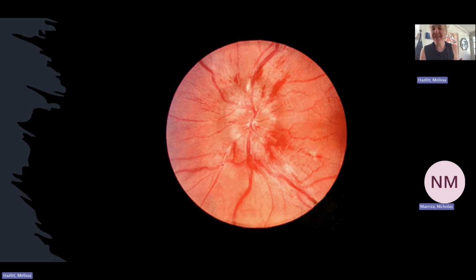I barely remember making these slides. Yeah, I was going to say it looks like that. Maybe the blood and thunder, but I don't know. No, this is obviously cotton wool spots. I think we all can agree that we would 100% recognize that on any of our ophthalmoscope exams that we pursue within the emergency department.